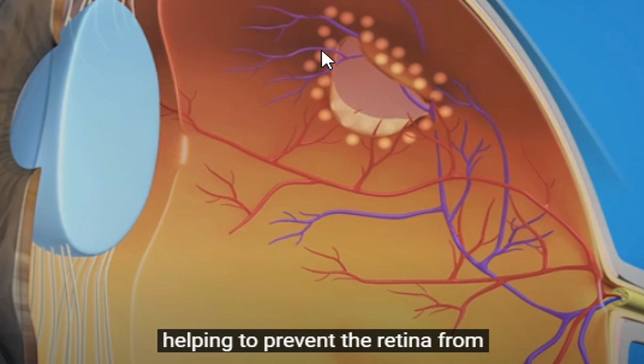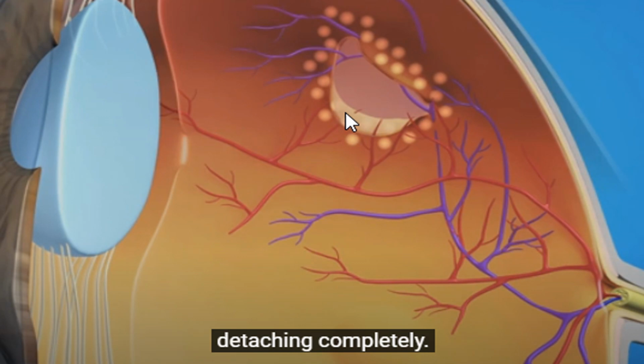But we are stopping the progression and complications from this tear, because this tear may turn into a horseshoe or U-shaped or fish-mouth tear, which will keep elevating and separating until it reaches the macula and you have macula off, and your patient becomes blind. So we are stopping the progress of this tear, and also stopping the leakage of fluid that has entered from the tear. We're not just sealing the tear, we're stopping the subretinal fluid that causes rhegmatogenous RD. So it's very important to have this laser photocoagulation as soon as possible. The earlier the laser, the fewer the complications. This is how we make two rows, especially on the side of the macula. Typically, it should be done all around.